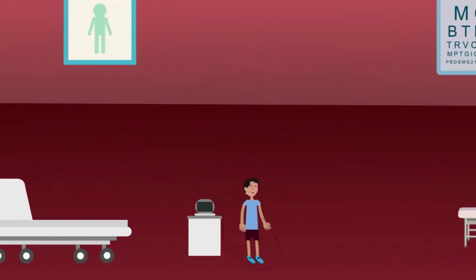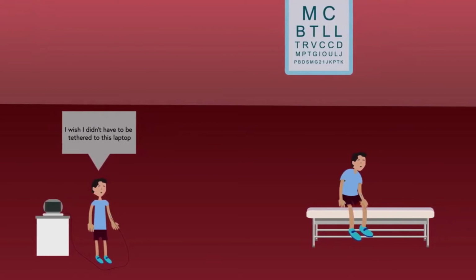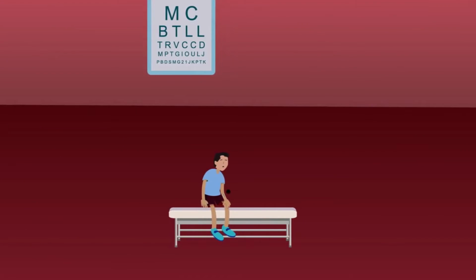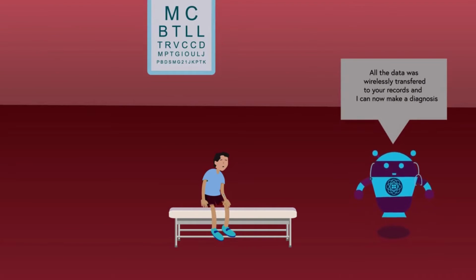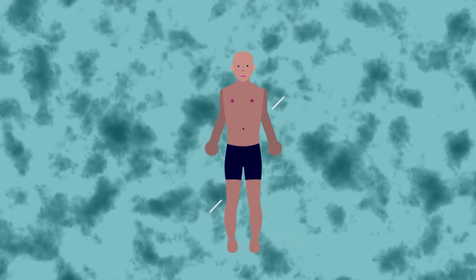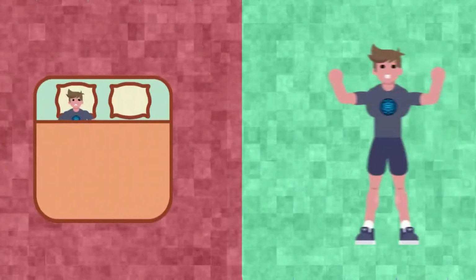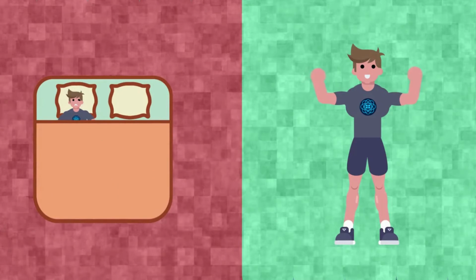However, the ultra-thin sensor at the moment is confined by the fact that it needs to be connected to a computer to transmit EMG data, so there is now research being done on creating circuitry for efficient wireless transmission of the signal to a computer or mobile app where it can be processed and viewed by the patient's physician. So what exactly do researchers hope to do with such breakthroughs? Well, this will change the game when it comes to diagnosis and managing conditions. For example, the initial weeks after a stroke are crucial for the patient to be able to train their neural circuits to improve motor function.